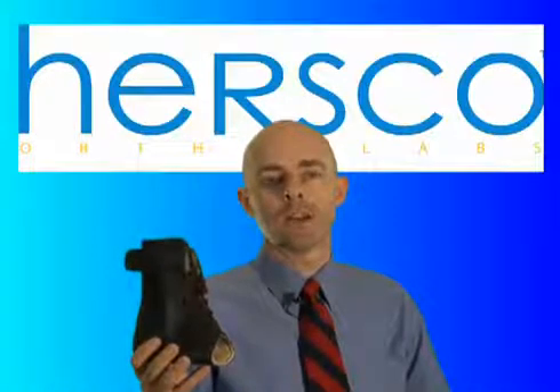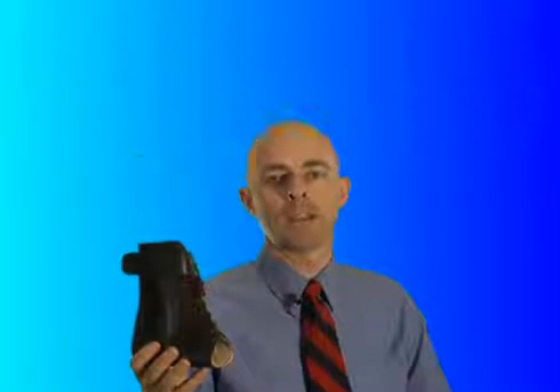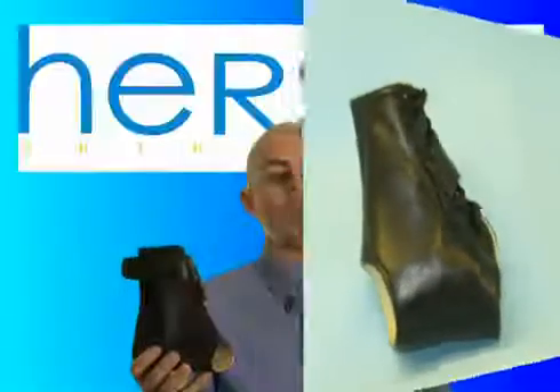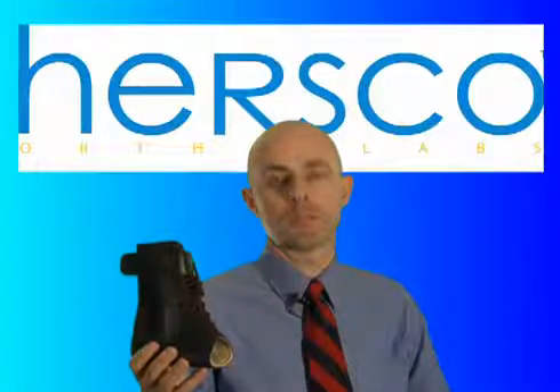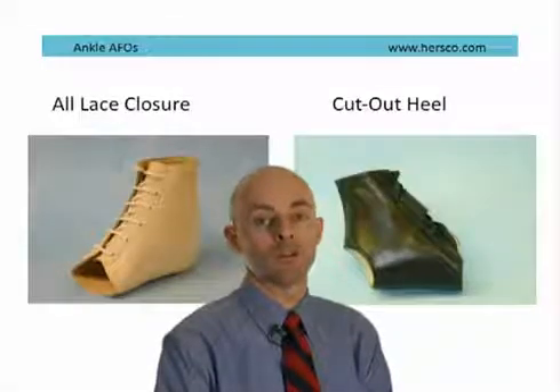A traditional ankle gauntlet, on the other hand, encompasses the entire foot and ankle complex and has a closure, usually consisting of laces or velcro. It offers more control and it's used for the same indications as the Ritchie brace, but is often better for patients who are heavier or who have a more serious version of the disease. Patient-specific considerations will determine the choice of closure — you can have lace, velcro or some combination of both.